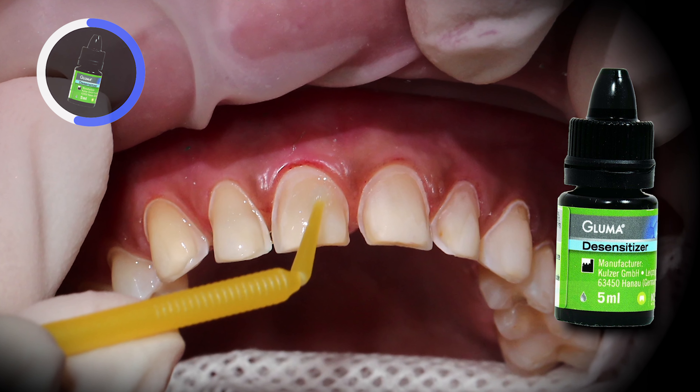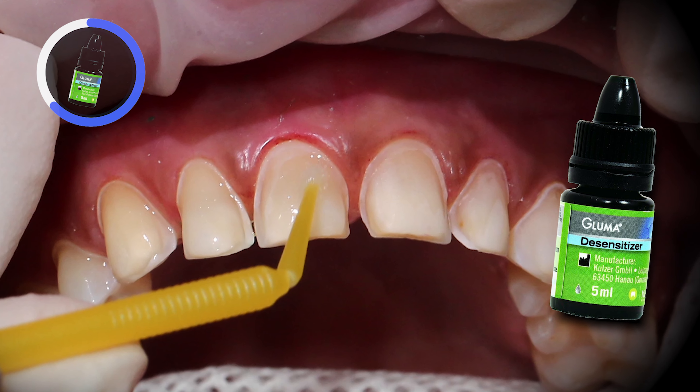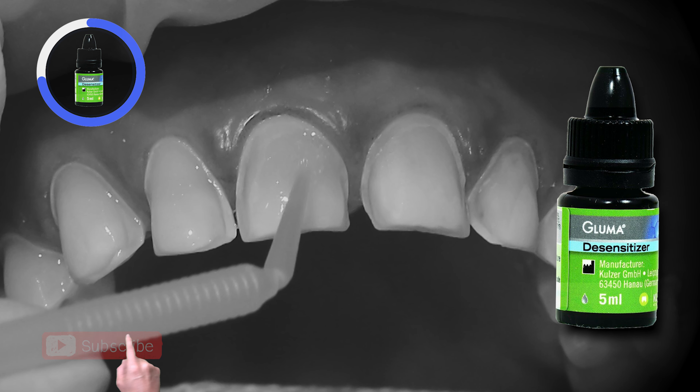Very gentle pressure at a speed of 2,000 RPM will do the trick. I finish cleaning the preparations with a prophy cup and pumice paste at a very slow speed of about 2,000 to 3,000 RPM.